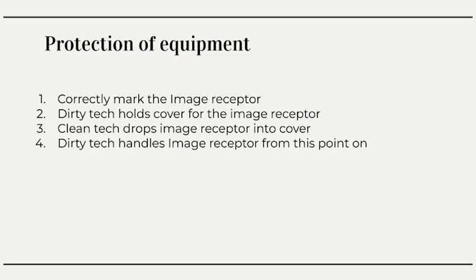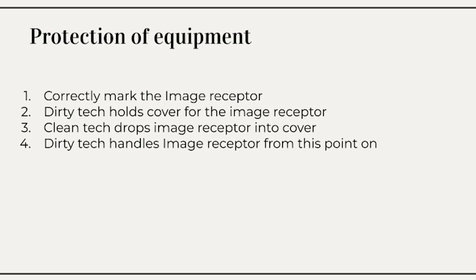Protection of equipment. Correctly mark the image receptor. The dirty tech holds the cover for the image receptor. The clean tech drops the image receptor into the cover. The dirty tech handles the image receptor from this point on.